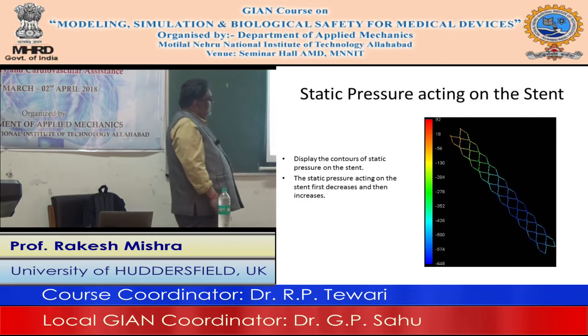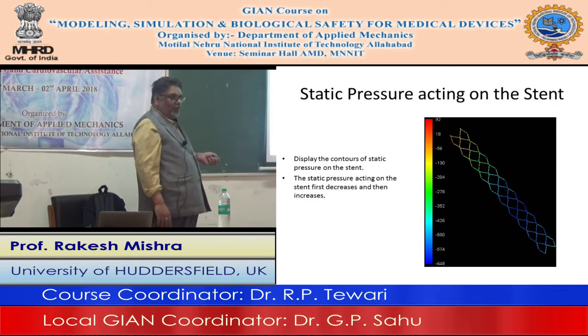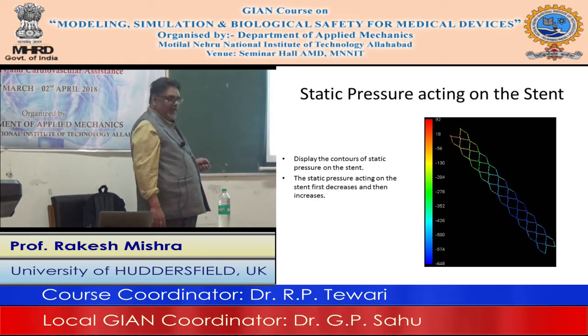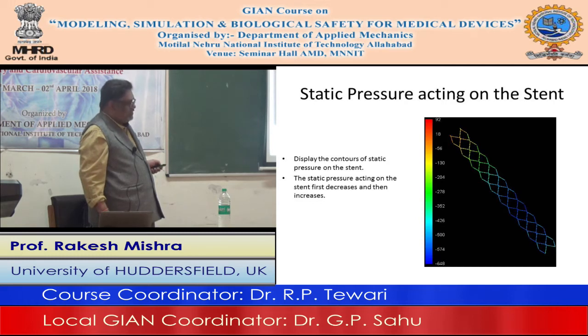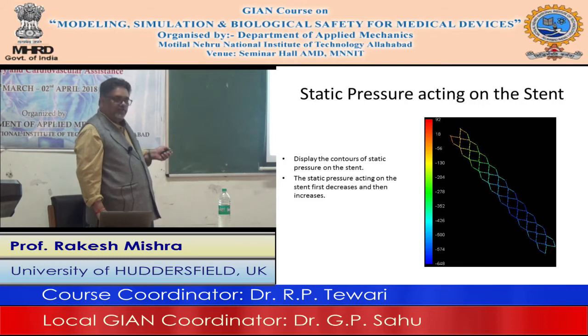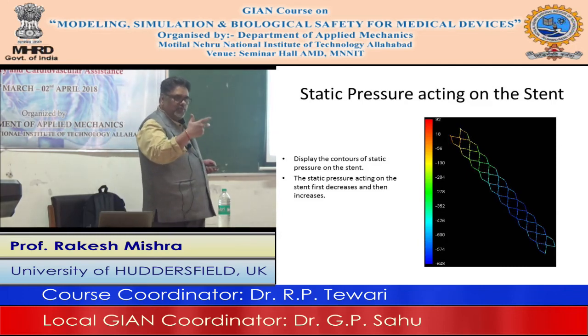Since we have established that in the stented region from the center of the artery pressure is changing, now I would like to see what is happening to my stent. This is a stent. This shows static pressure distribution in the stent, and as you can see near the junction here static pressure is okay, but in this part static pressure has gone down because of this effect. You can see this effect here. So static pressure is reasonable, then it goes down, then it slowly picks up. So on the stent itself the static pressure is reasonable here, goes down here and picks up here. Okay, so this is how the stent elements are being exposed to pressure that you can calculate.